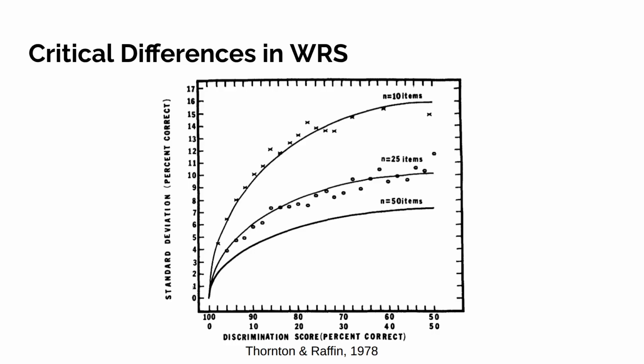As you move towards 50 on the right, we see all of these curves move up. So greatest variability around 50%, lowest variability around 0 and 100%. Why is variability lower around 0 and 100%? That's pretty straightforward. We're limited by the ceiling effect and the floor effect. You can't go higher than 100. You can't go smaller than 0.